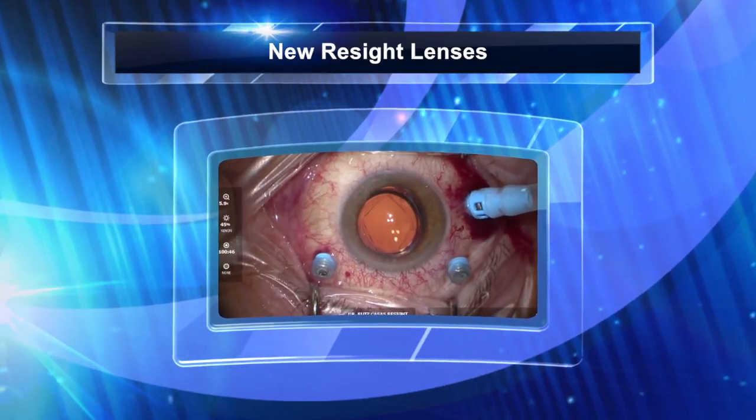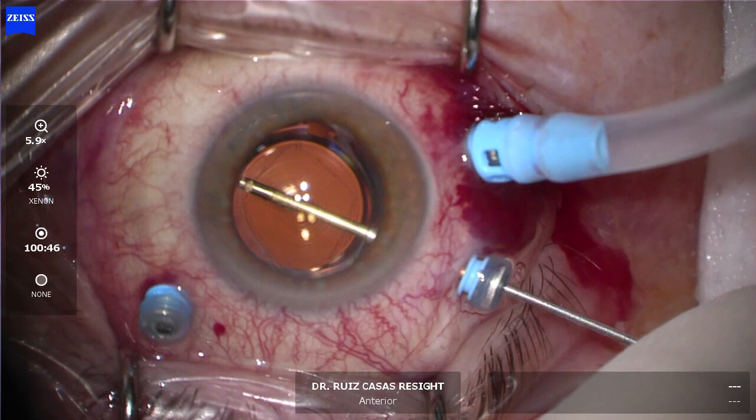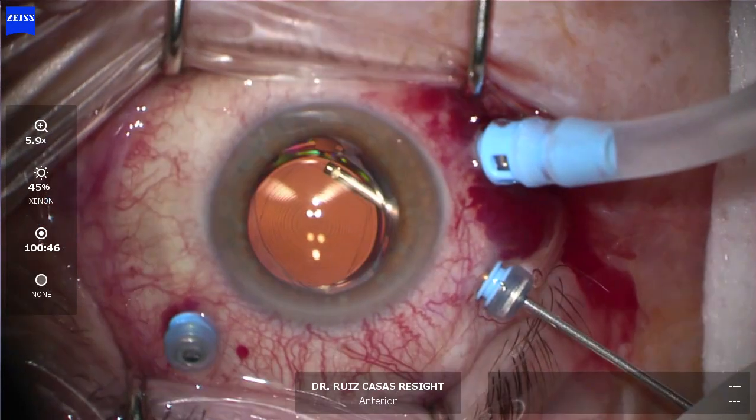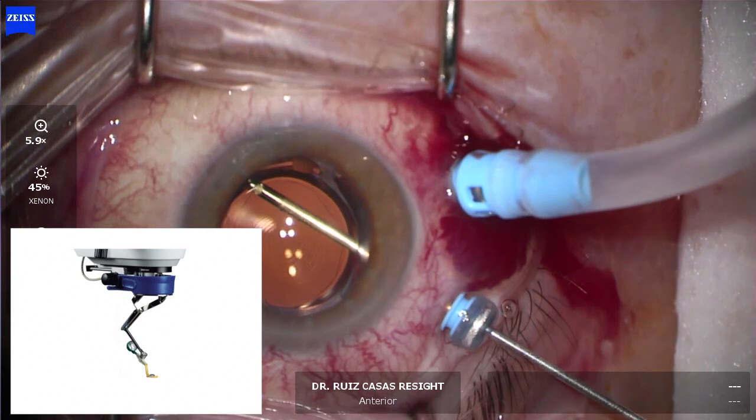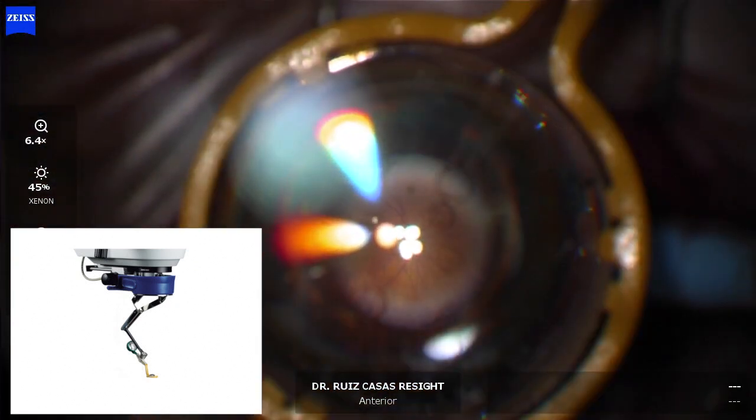In this video, I'm showing you the new Resight disposable lenses. This is a case in which I'm operating for floaters and the patient has a diffractive pseudophakia.